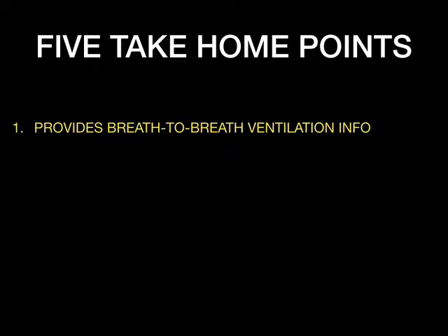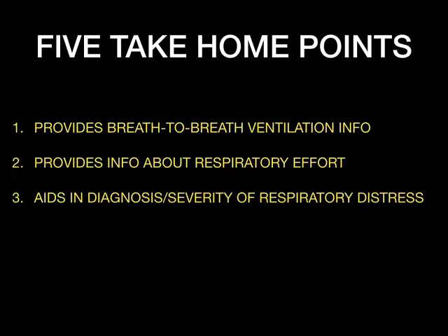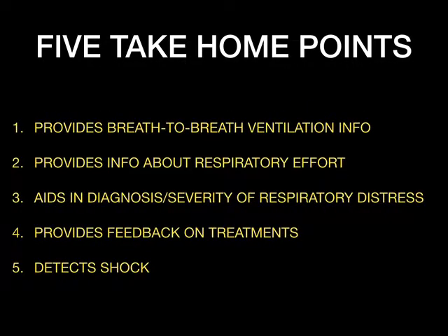In this lecture, I want to go through 5 take-home points about ETCO2, capnometry, and capnography. First, ETCO2 provides breath-to-breath ventilation info. Second, it provides information about the actual respiratory effort. Third, it helps aid in diagnosis of respiratory distress and the severity of respiratory distress. It provides real-time feedback on treatments given. And lastly, it detects shock. Where you see the yellow are the important slides to remember.